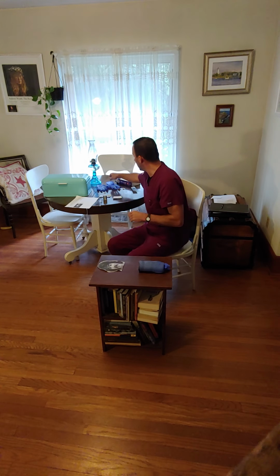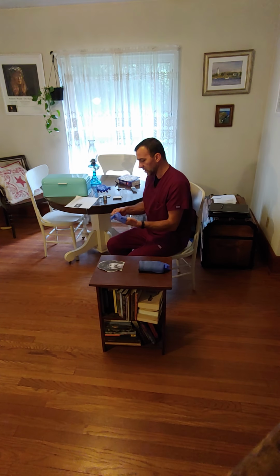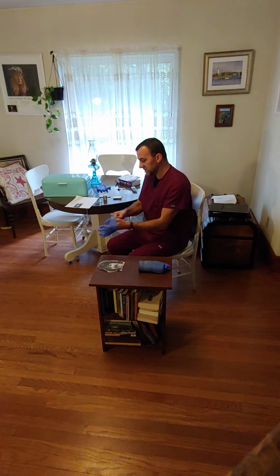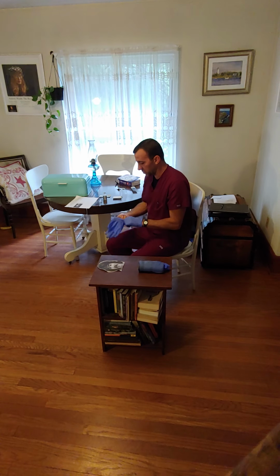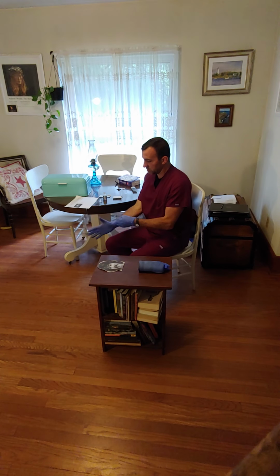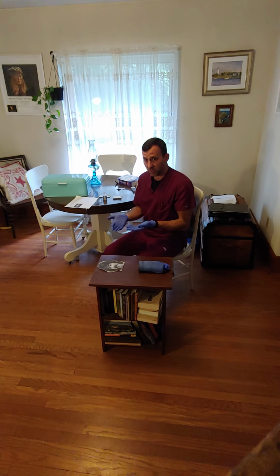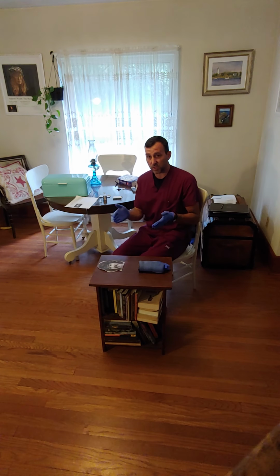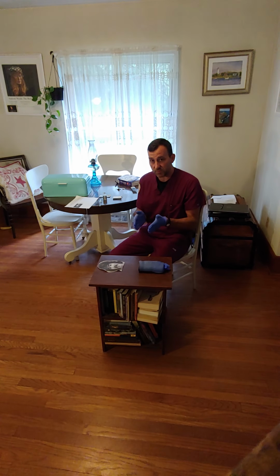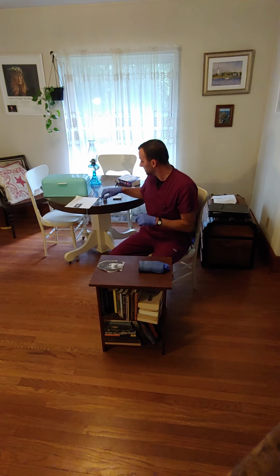So again, I'm going to do hand hygiene. I'm going to don my gloves. And because we're injecting 2 milliliters, I'm going to choose not to go with the deltoid and go with a larger muscle, the vastus lateralis. So we're going to help Mr. Prine onto his side. We're just going to expose the lateral aspect of his thigh. I'm going to use the landmarks of the greater trochanter and the patella. I'm going to go halfway in between those on the lateral aspect of the thigh. That's going to be our vastus lateralis.